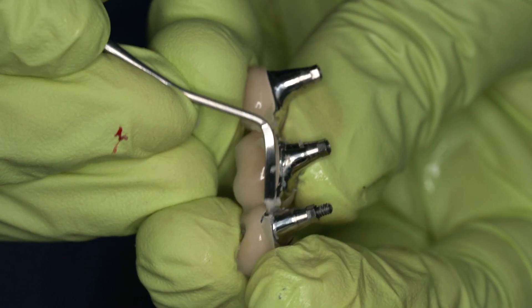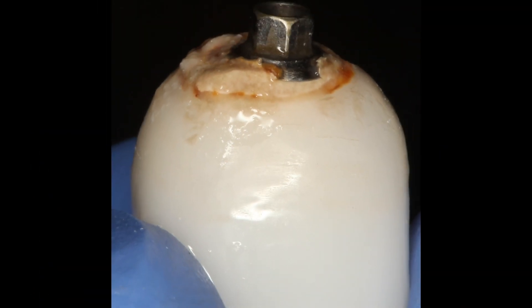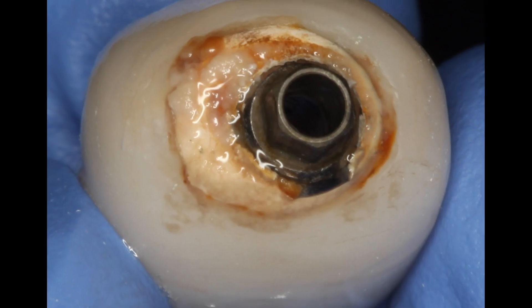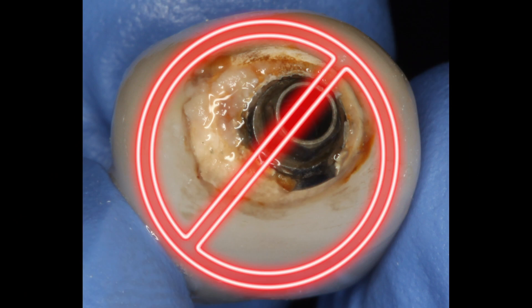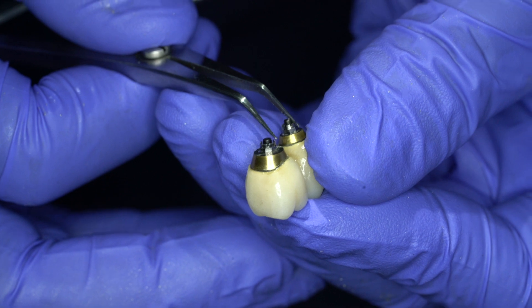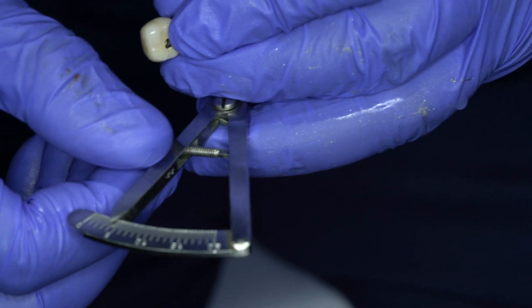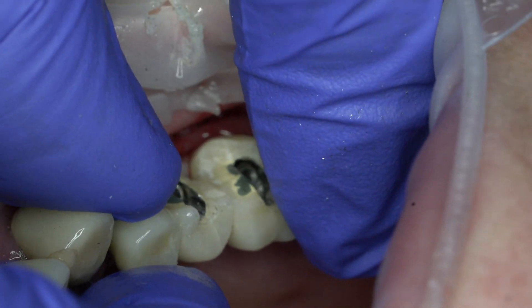After removing the crowns, they must be washed and freed of cement residues, which unfortunately always exist. Therefore, we strongly discourage cement fixation. Once the abutment has been cleaned, photographs of the implant and abutment interface can be taken to help identify the system and its features. The extracted crowns can be used as a temporary.